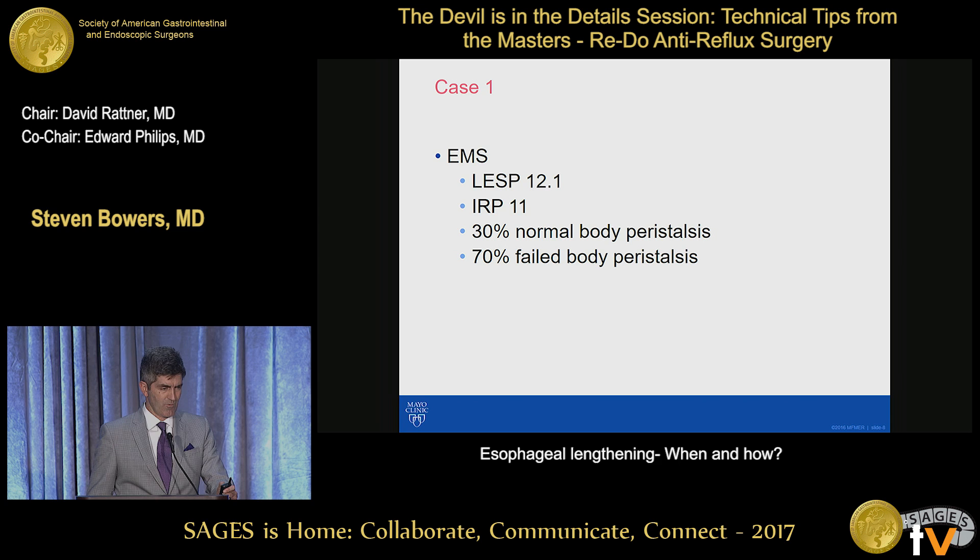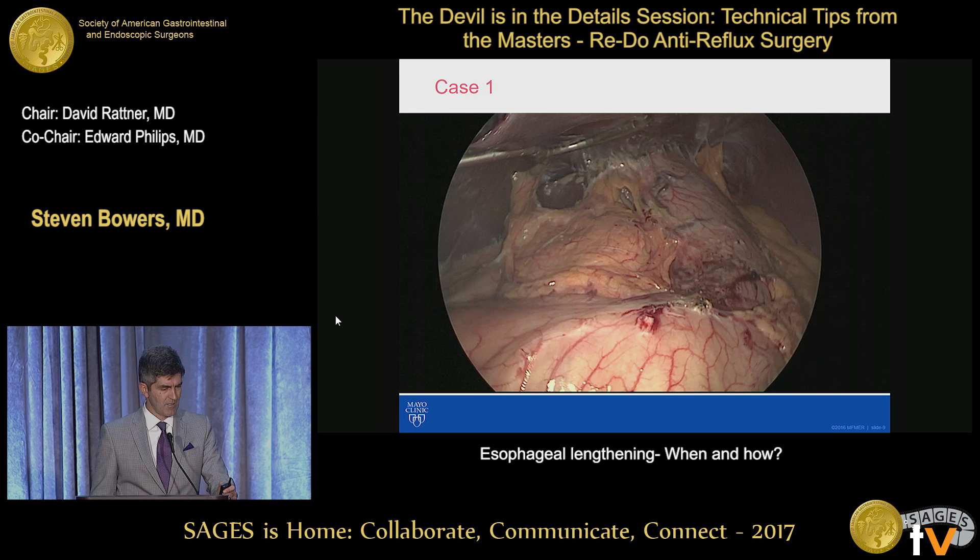And here's on retroflex. So our current assessment was reasonable for Nissen fundoplication.